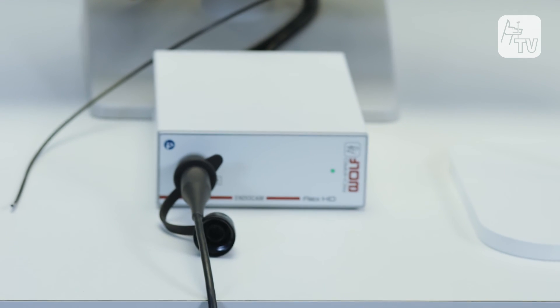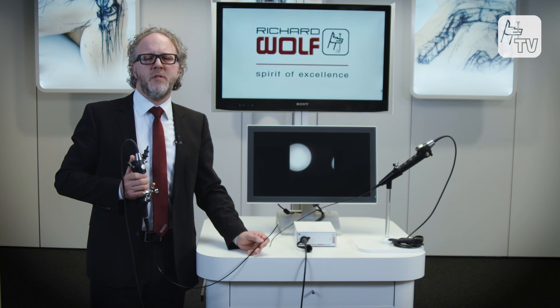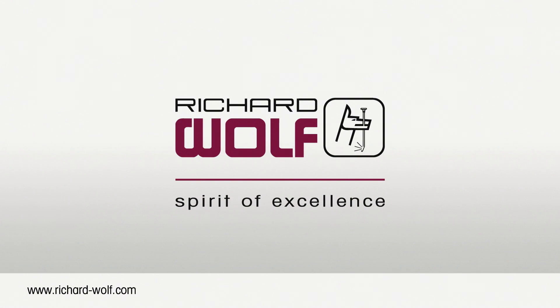Flexible video cystoscopy and flexible video ureteroscopy with the unique EndoCam Flex HD controller create an optimum and cost-effective high-end endo-urological overall concept. Richard Wolf — spirit of excellence.